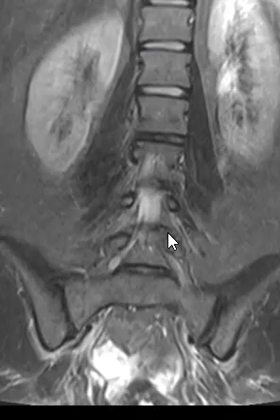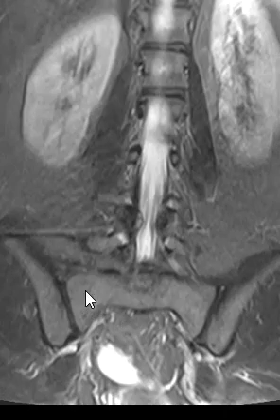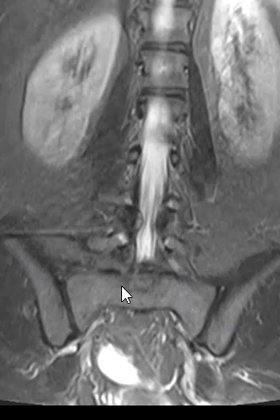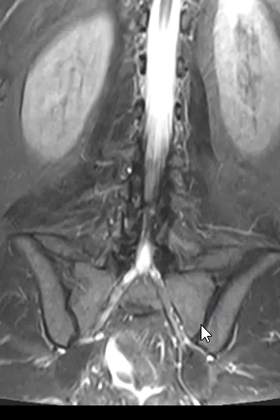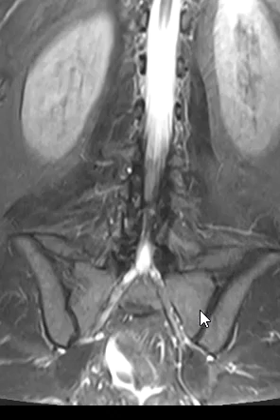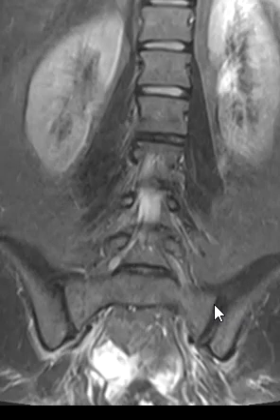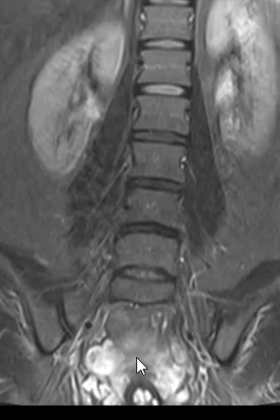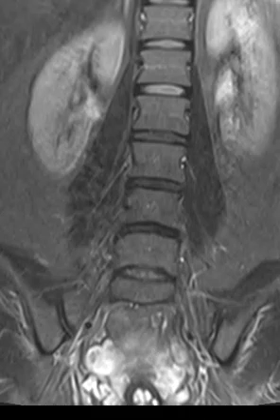Looking down lower we can see the sacrum, the ilium on the left, and the ilium on the right. Where the sacrum and ilium come together we have the right SI joint and left SI joint. This gives us a quick look to see if they have sacroiliitis, a sacral stress fracture, or any tumor in the bony or soft tissue pelvis.